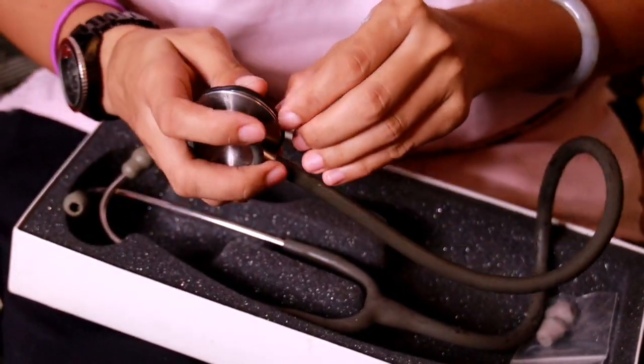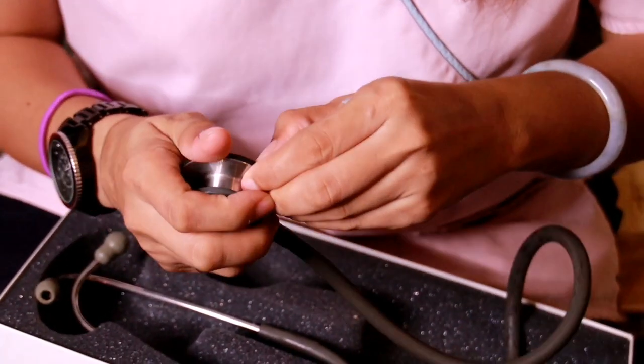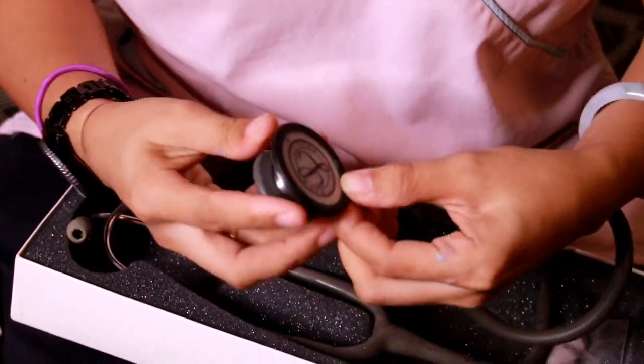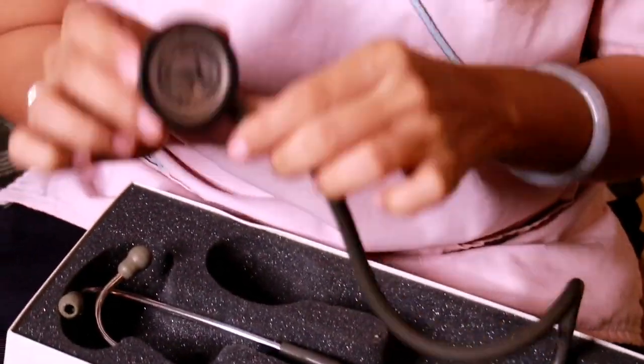You just put it in now — there's a mark here where you can have the ring attached and snug perfectly. So that's it, it's that easy!